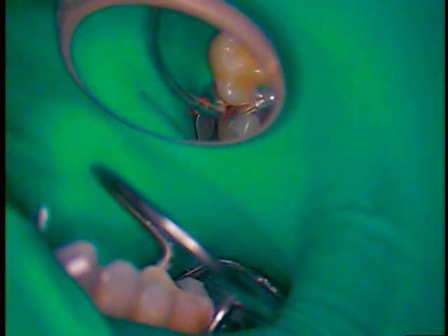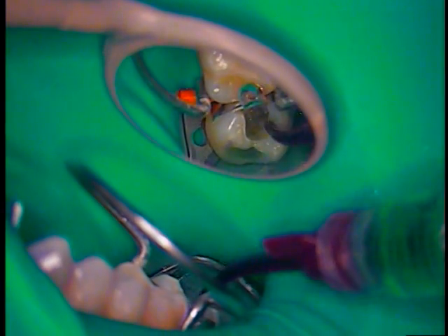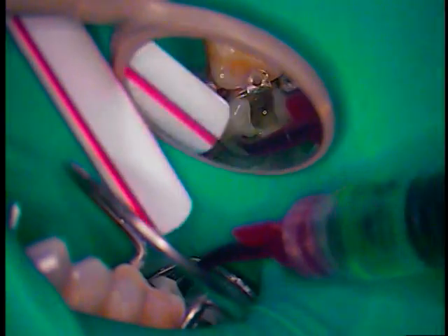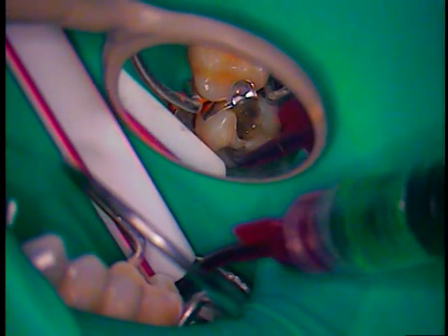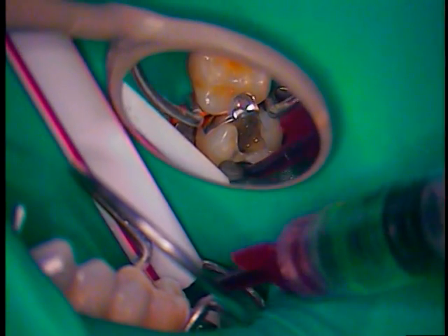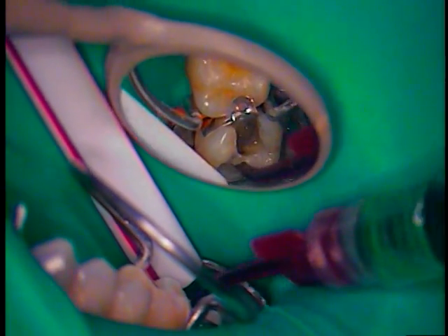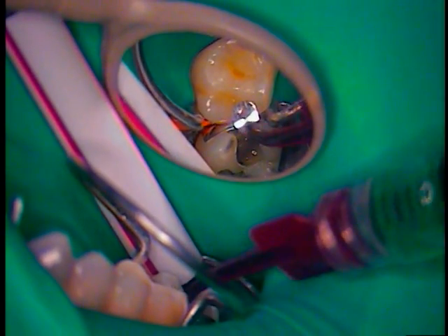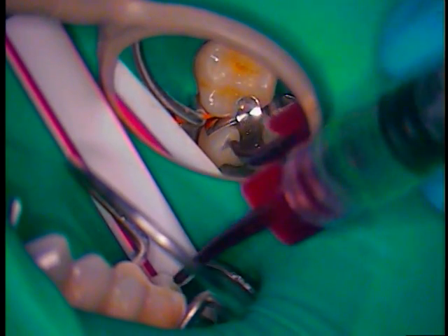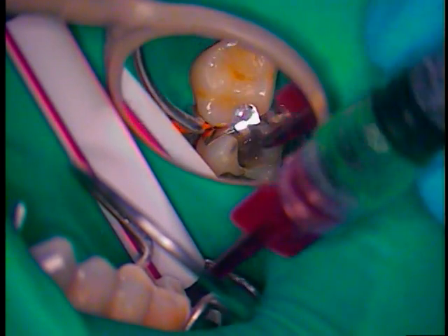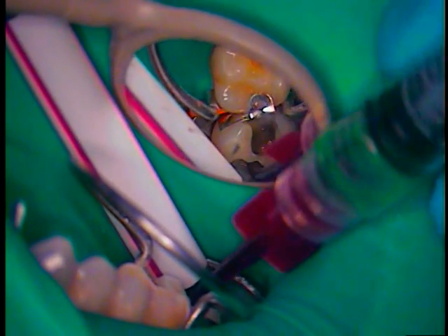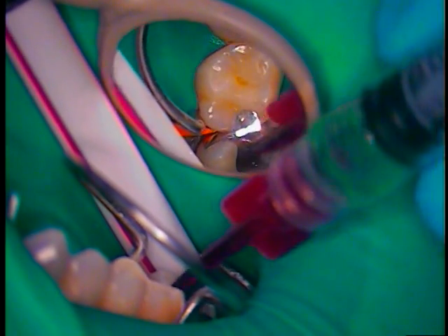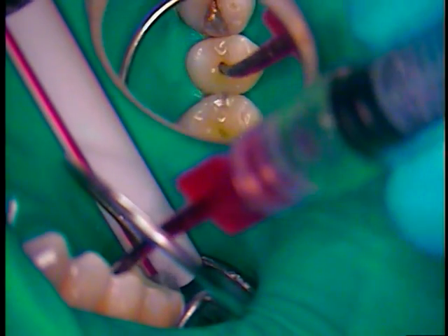Back in with the cleaner. So this is cavity cleanser, chlorhexidine gluconate. I'll rinse all them again.